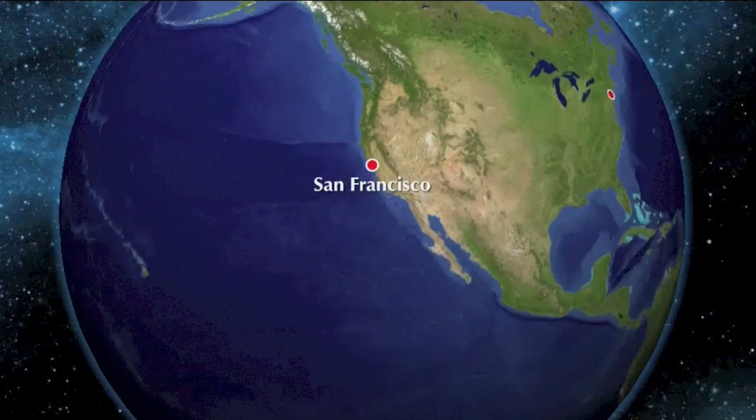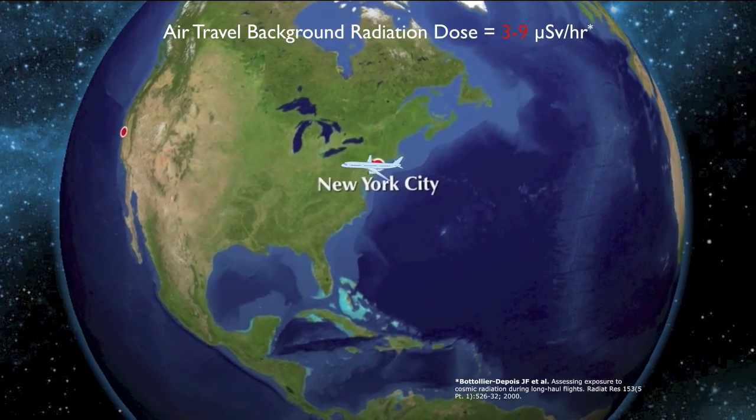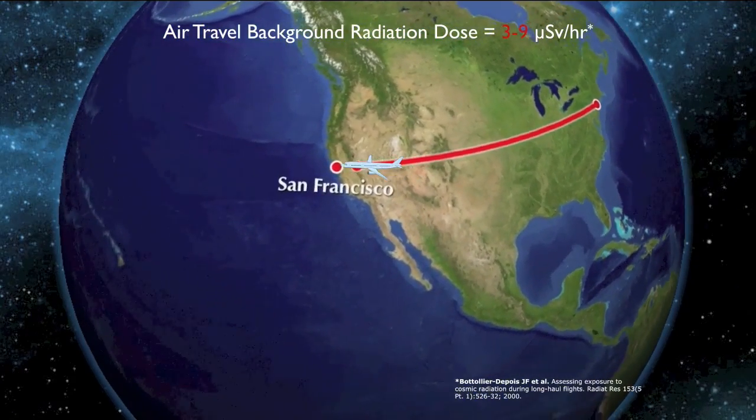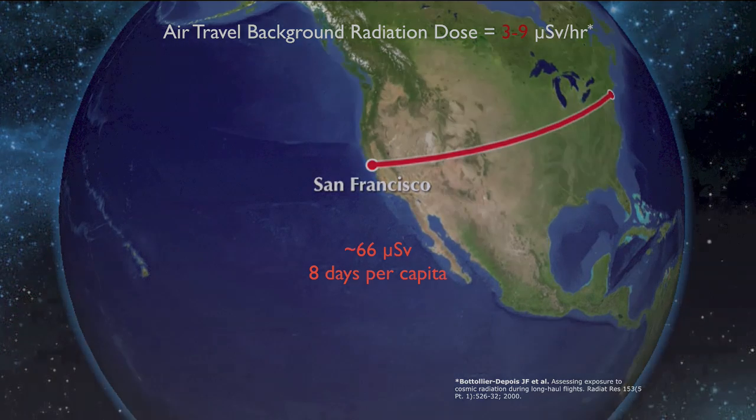Now, for those of you that have looked at the previous podcast, you'll know that I reviewed some of the dosimetry data that was studied regarding pilots and flight attendants, and we did discover through lots of research that any air travel is associated with 3 to 9 microsieverts per hour of air travel. So again, if you're taking a flight from the West Coast to the East Coast and back, you're exposed to about 66 microsieverts, or 8 days per capita.